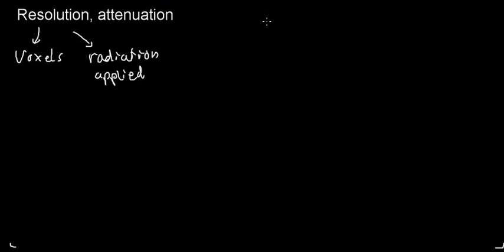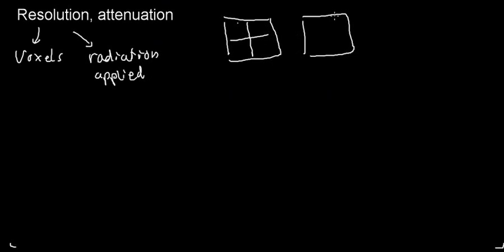You may guess that if I have 2 units of the same volume, this unit is spread to, let's say, 2 voxels per row, and this one would have 5 voxels per row.